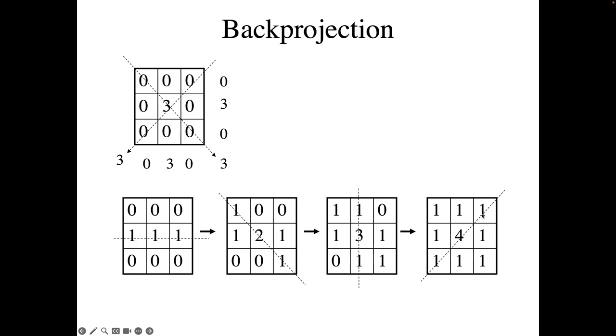So we've done a trivial thing, right? And we get an image that's not too bad. I mean, it's got a peak in the middle. It's got a kind of a uniform baseline. But importantly, it is not the object, right? It is an incorrect image, but it is related to the object by something.